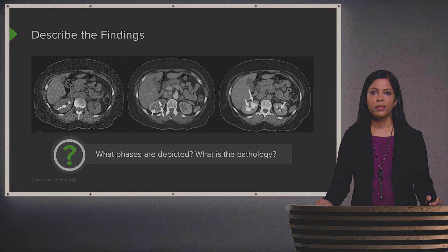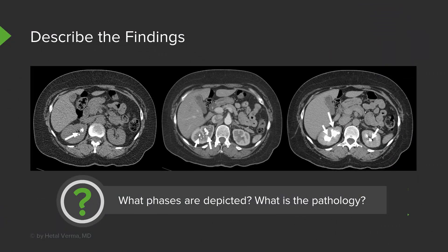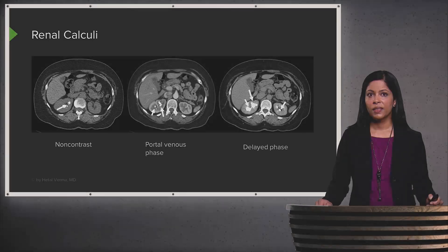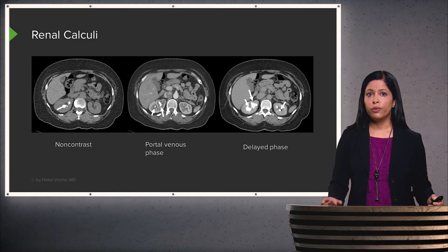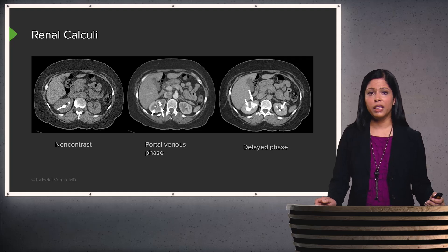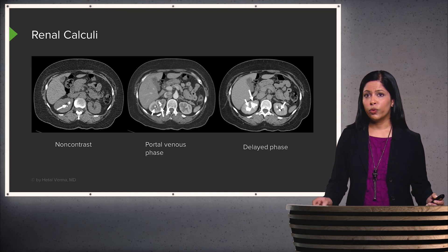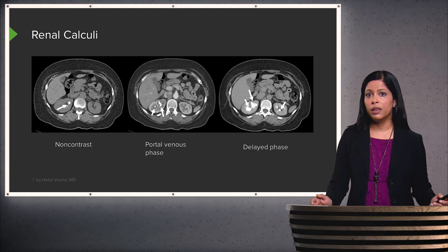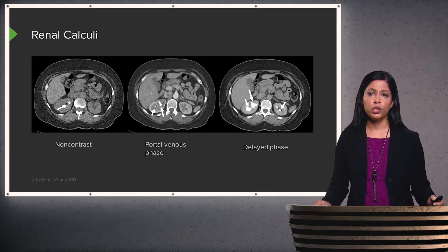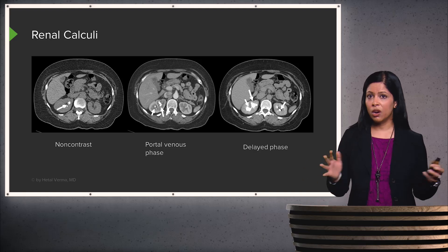This case example shows renal calculi across different imaging phases. The non-contrast scan shows a high-density stone within the kidney. The portal venous phase also shows the stone with surrounding contrast. However, on the delayed phase — performed at about 10 minutes — there is a large amount of contrast within the renal pelvis that obscures the stone. This is why you should not give contrast when suspecting a renal calculus, as the contrast may hide the stone.